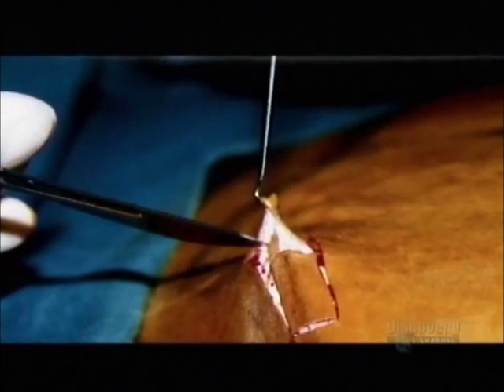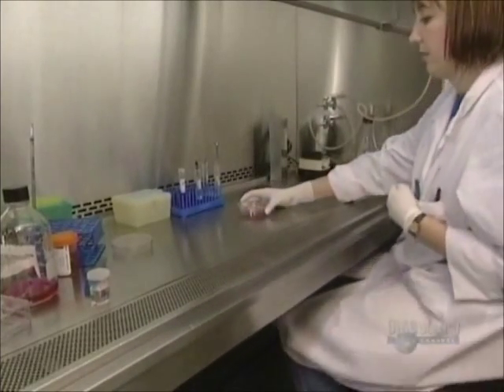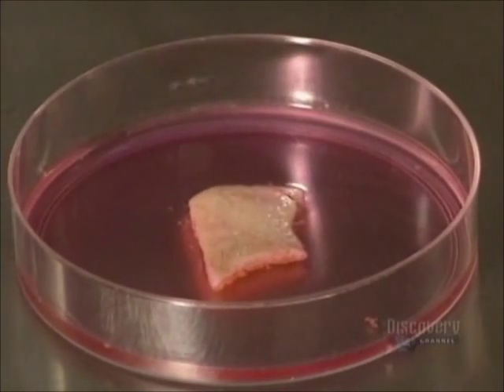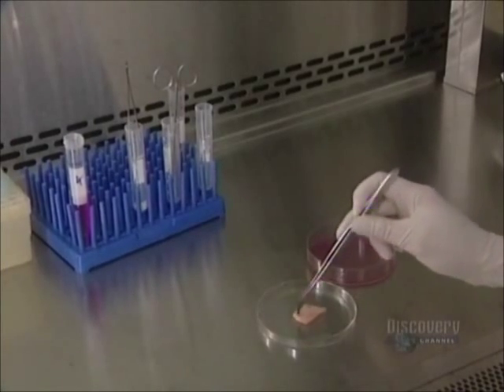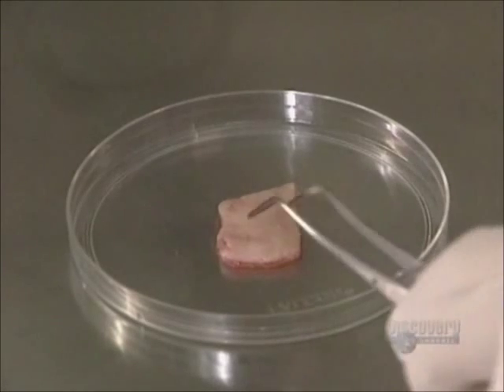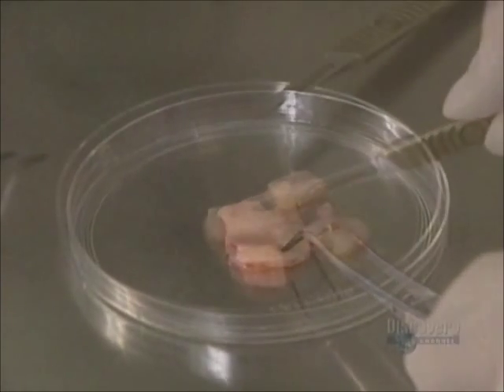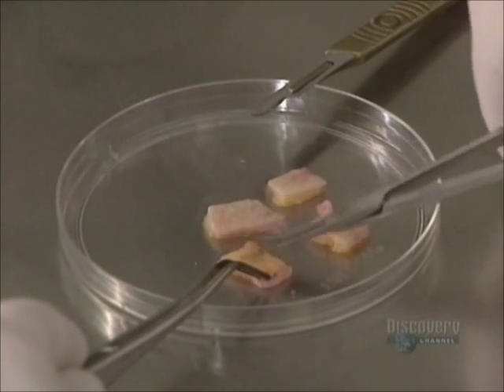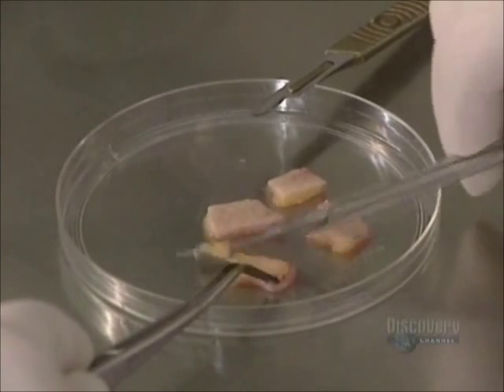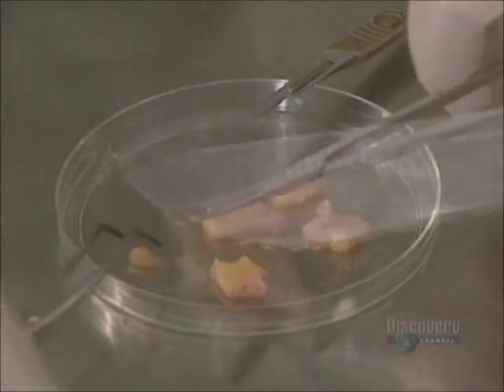It all begins with the removal of a small skin sample. The 10 million cells in this piece are enough to make a cultured skin. The skin soaks in a medium containing penicillin and gentamicin, antibiotics which protect it from bacterial infection. Then a piece of skin is cut and delicately sectioned on a petri dish with a scalpel, and the fat is gently detached from the dermis since it will not be needed in the culturing.